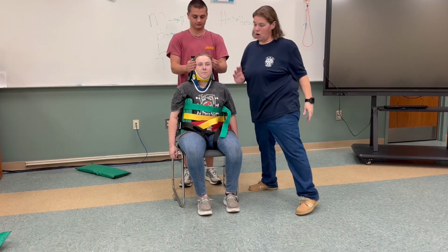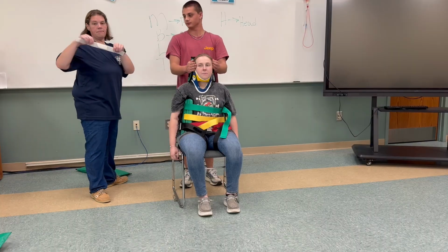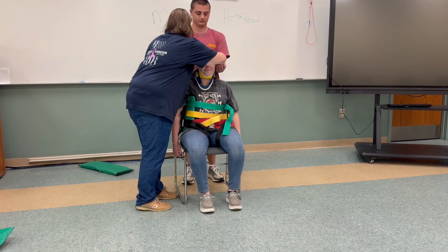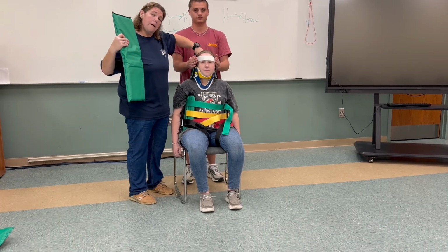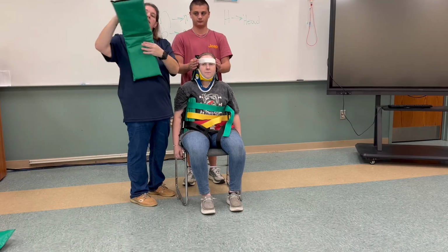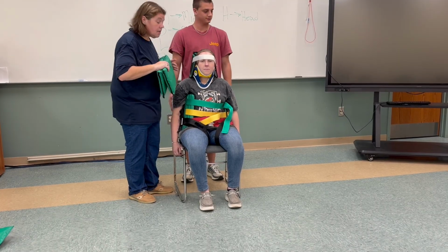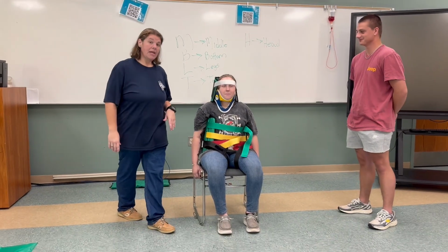Thank you. All right. So every device comes with a strap. Okay? You will take this and place it just across the head. Okay? And you may need, keep holding that just for a second. You may need to fill the void back behind the head. And this is what this is for. You can slide it in, fold it in half, whatever you may need. Hers does not need to go. So you can let go of C-spine. She's fully immobilized.